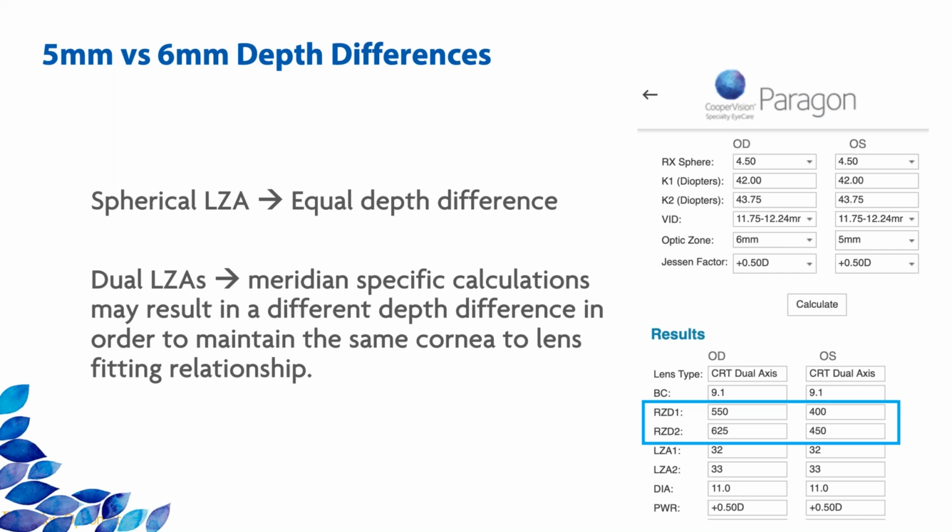But keep in mind that we only have one chance of getting a good baseline topography. So I would urge everybody, if you're not too busy, probably get two different sets of topography, one with central fixation, one with nasal fixation, for those with significant angle kappa.